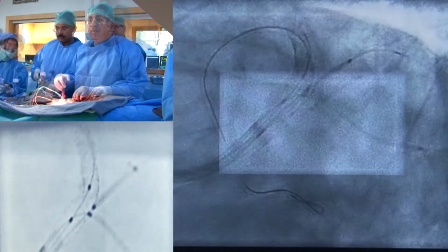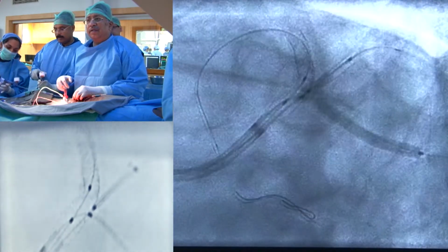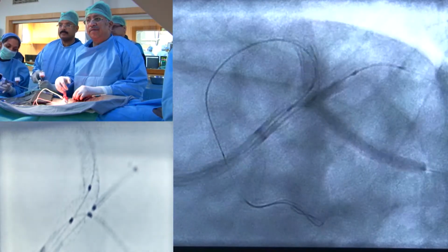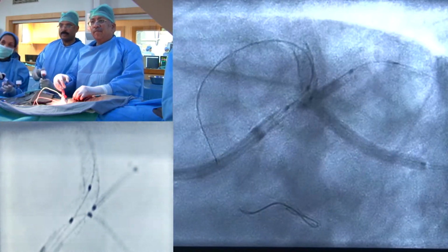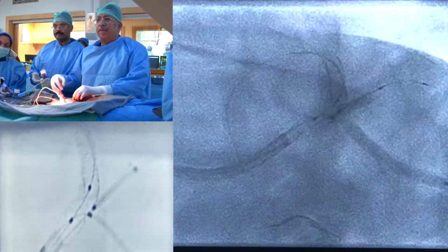That's the stent boost of the stents in the ramus and the circumflex, and I think we have just a minimal protrusion because these are the Xience stents, and the struts come right up to the mid part of the marker. Right, okay. So now we're going to go and deploy these 2. 4, 6, 8, 10, 12. Okay, 12. I think let's just hold on there before we pull it back.